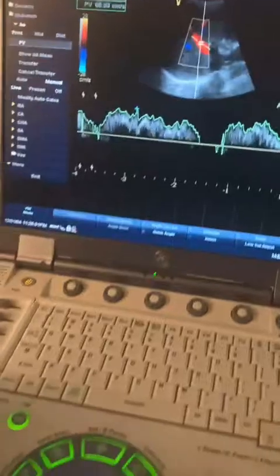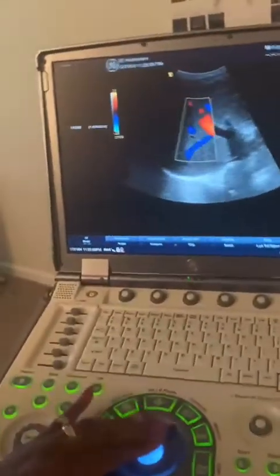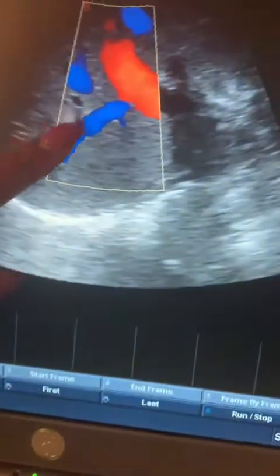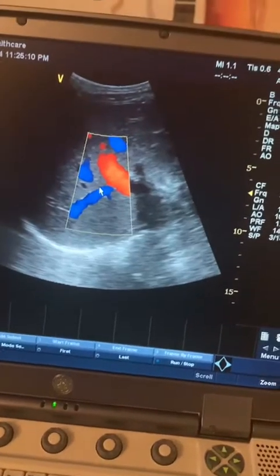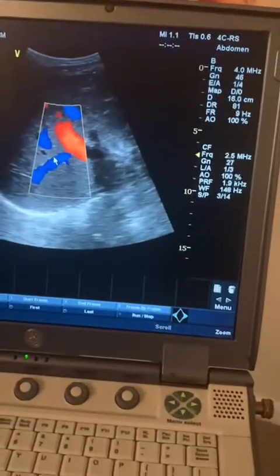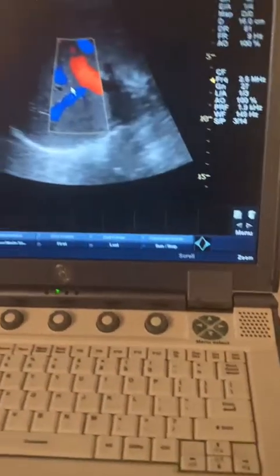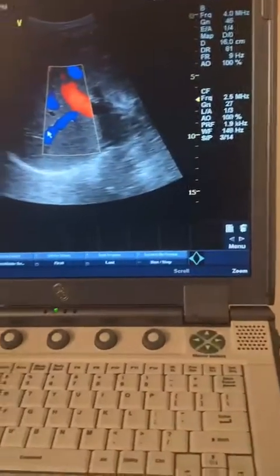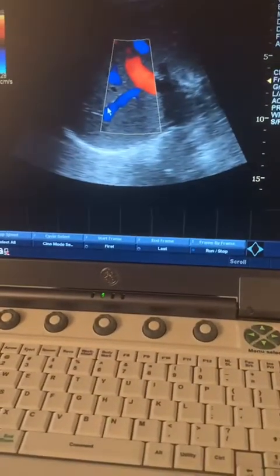That is your main portal vein. After you've done your main portal vein, you can also look at your right portal vein from that view. You can see in this view the main portal vein and the right portal vein. The right portal vein — even though it feeds the liver — because of the angle where I'm hitting that vessel, I'm getting a negative doppler shift. It's not necessarily going towards the transducer, so the right portal vein would show a negative doppler shift.